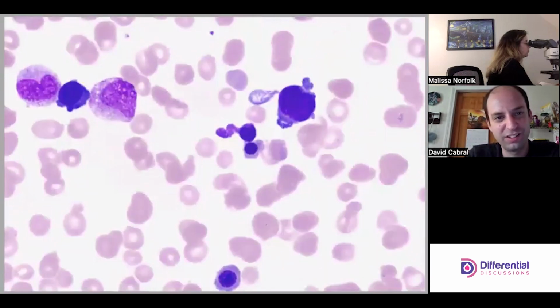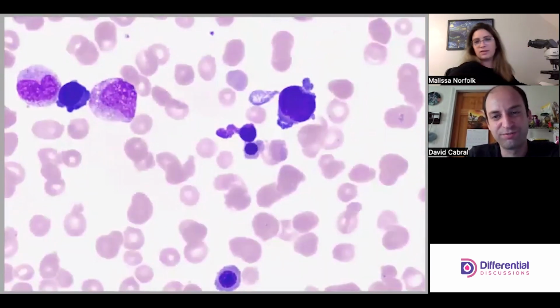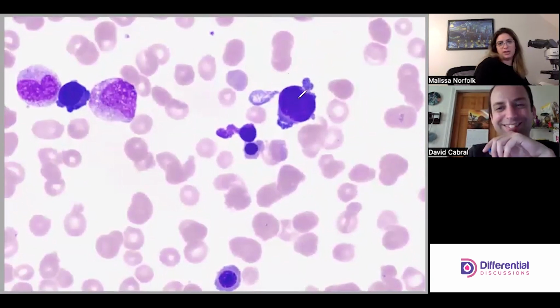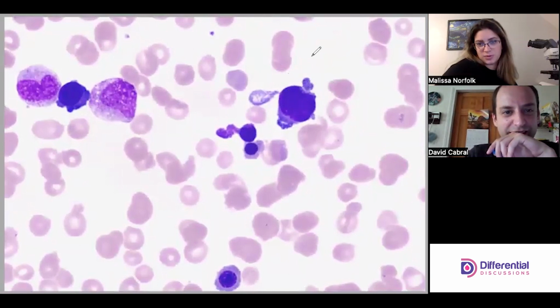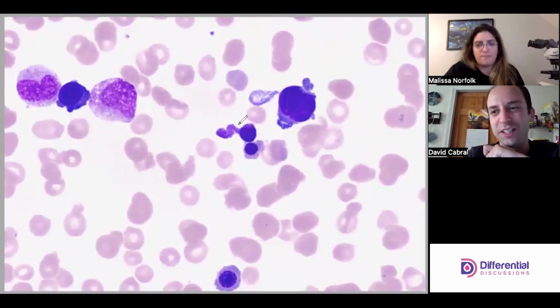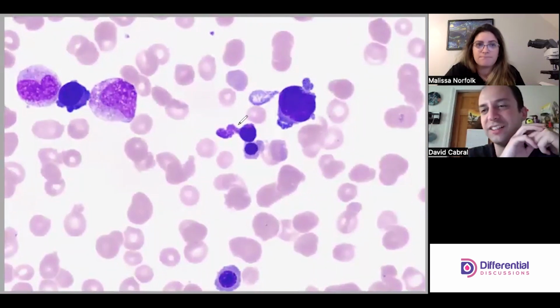Wow. Look how dark those cells are. This one's funky looking. It's kind of like, wait, are they bilobed? It looks like this one is bilobed. So again, this is one of the abnormals. It also looks like this little guy here is another abnormal one. So look at the variation in presentation of these cells. It's so bizarre. For all three of them to be the same thing is wild.